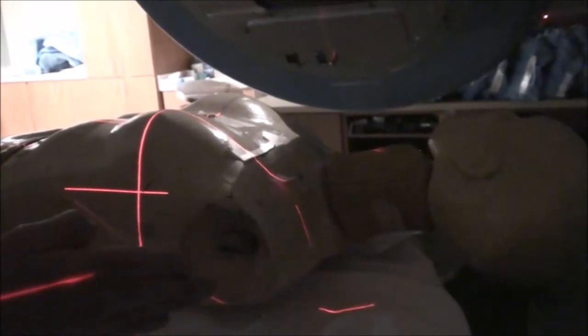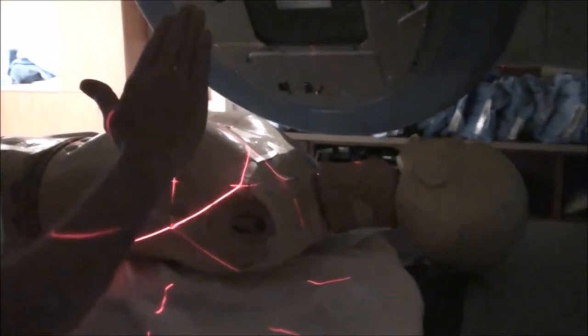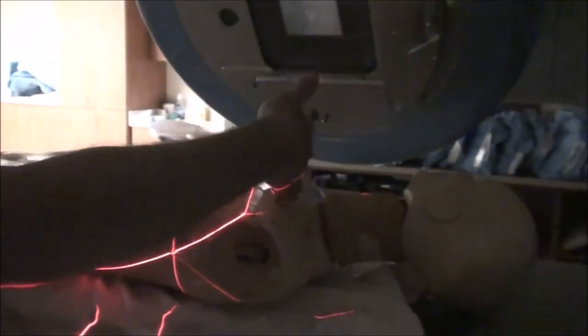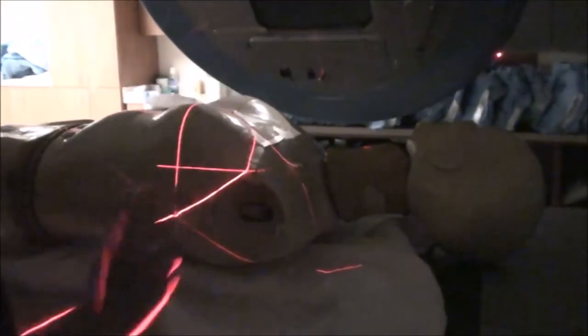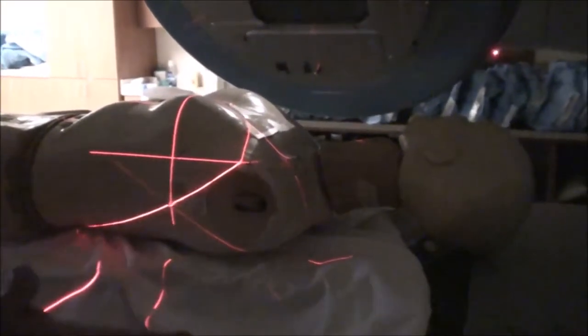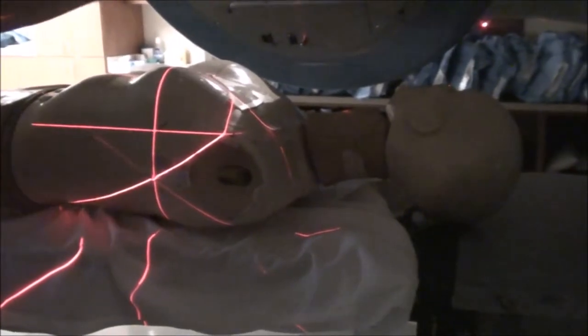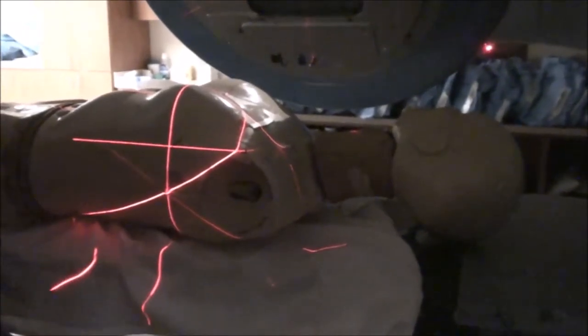That is how you determine if your divergence is correct, just like with the head and neck. Again, this is a head and neck setup flipped upside down and turned kind of sideways — if you think about it that way, it's not so difficult. We've just flip-flopped this, and now we've got to match to the inferior aspect of the supraclav instead of the superior aspect. We've kicked the table; we're matching that match line. When we go fluoroscope, we're looking at this match line and looking to cross both the medial and lateral wire. Once you've got all that in place and the proper amount of flash, you would increase the field size so that you had flash over the top.